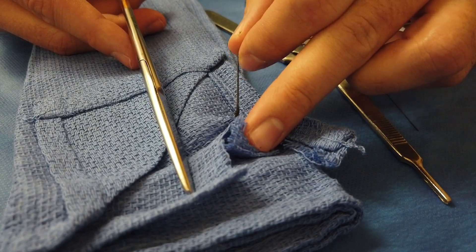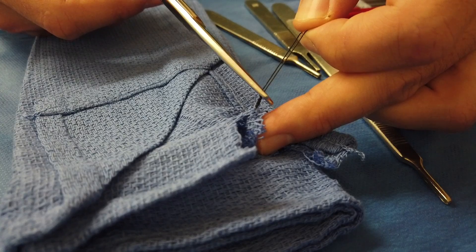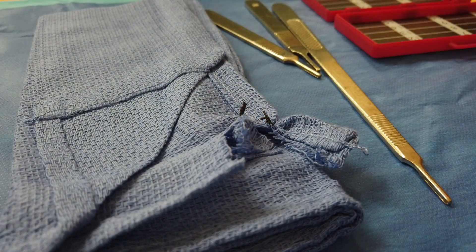For skin stitches, where you want as little tail as possible, slide the scissor all the way down to the knot until you feel it, then cut. It's key not to cut the knot — that's a skill that's learned and it still happens every now and then. Don't be worried if it happens; surgeons usually get upset but it does happen.